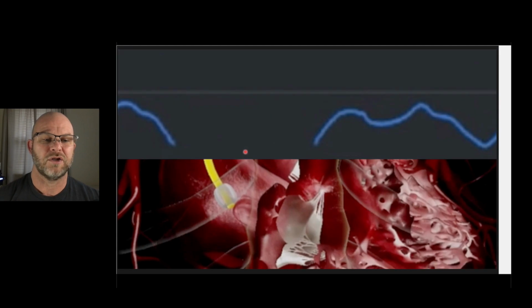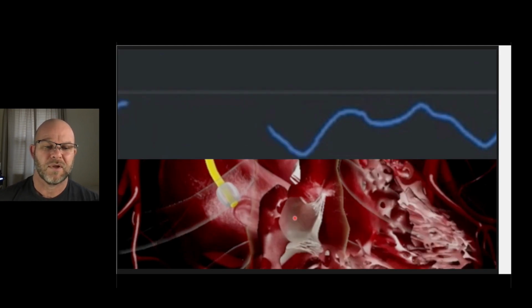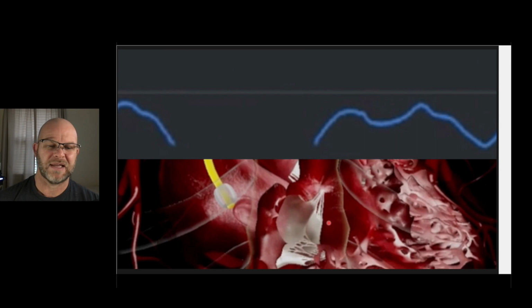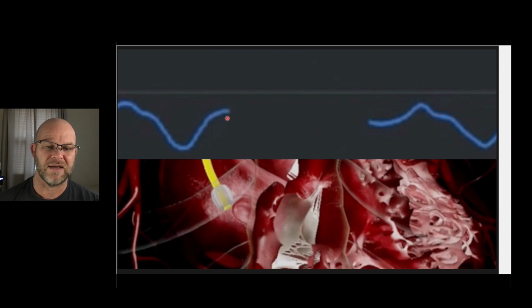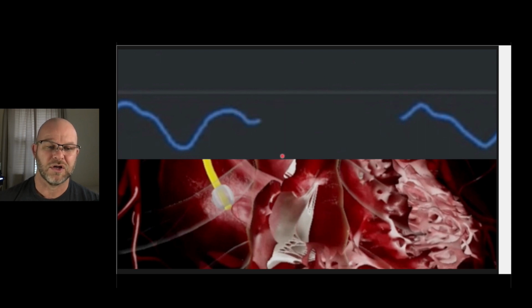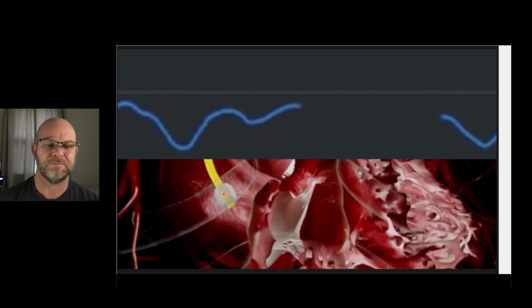And here's a slow motion example here. There would be your V wave. Here's your ventricle expanding, so it's filling. And then you have this last little kick here of stretching that muscle, and that's your A wave. And then once that A wave happens, now your ventricle is going to fire, closing all the valves back up, and this will start to fill again.